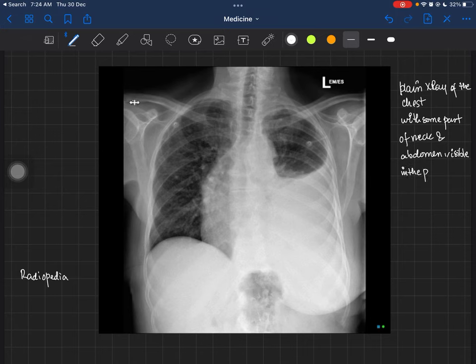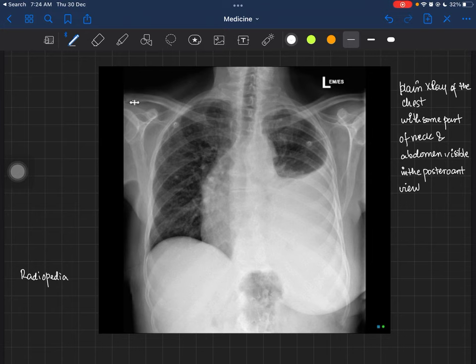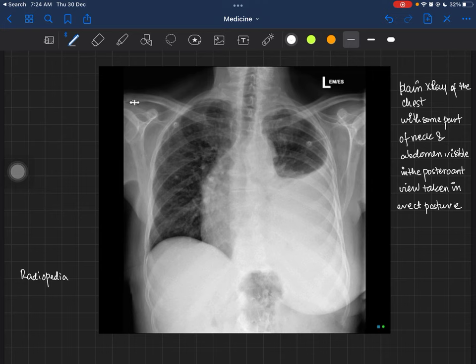The third evidence is the clavicles — they are also elevated because the hands are raised. These three facts together confirm this is a posterior-anterior view. Since this is a PA view, the person was most likely standing, so you can say this X-ray was taken in an erect posture.